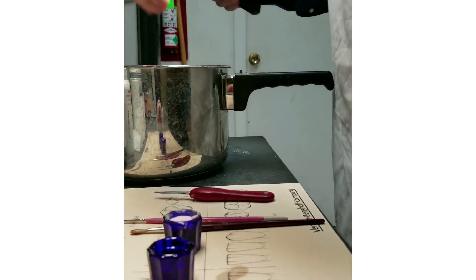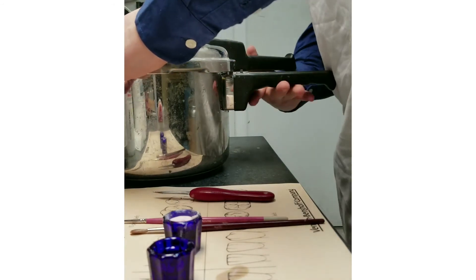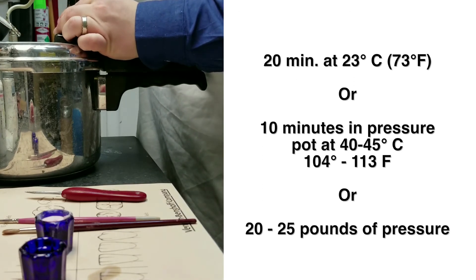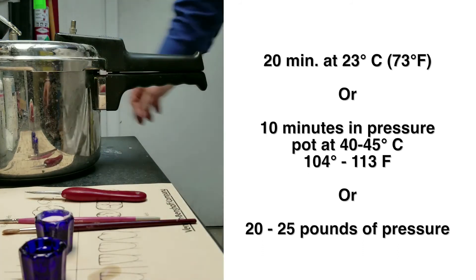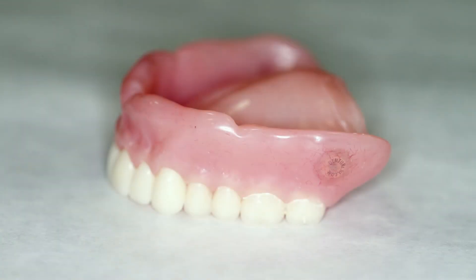Allow time to cure or use a pressure pot to prevent formation of bubbles. Cure time is approximately 20 minutes at 23 degrees Celsius (73 degrees Fahrenheit), or 10 minutes in a pressure pot at 40 to 45 degrees Celsius (104 to 113 degrees Fahrenheit) and 20 to 25 pounds pressure. Trim and polish in normal manner.